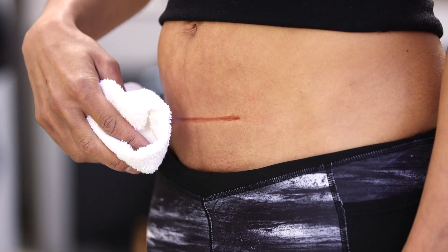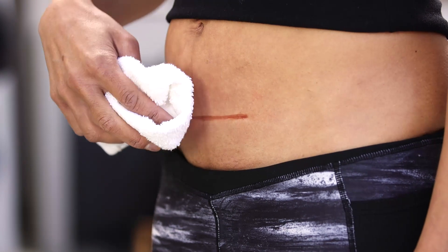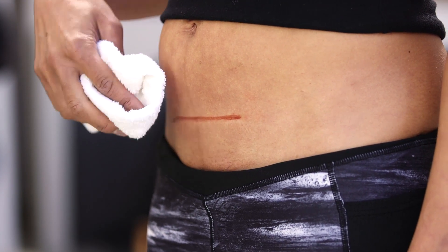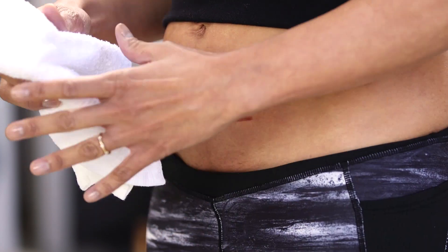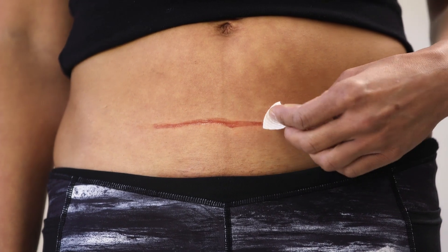Gently cleanse the area surrounding the scar with a washcloth, soap, and water. When possible, use bar soap. If your hairline is within the application area, please trim or cut the hair using a trimmer or scissors. Do not shave the area as this can cause irritation. Next, remove any oil or soap residue with alcohol wipes from the area surrounding the scar.